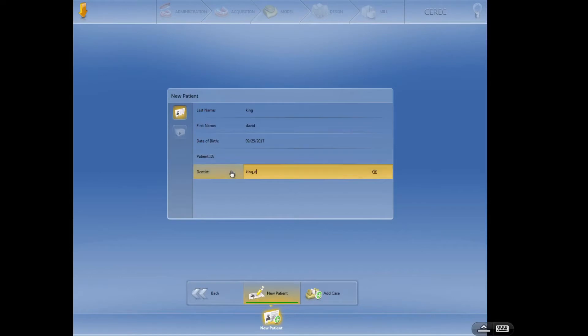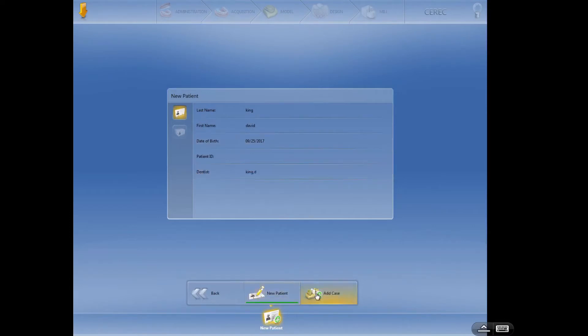So here we are. I've got the patient name, provider name, date of birth. Ideally that would be the patient's date of birth. Then I'm going to add a case.